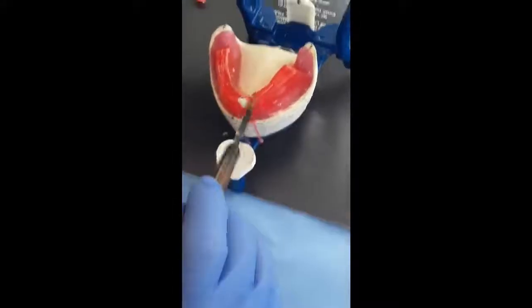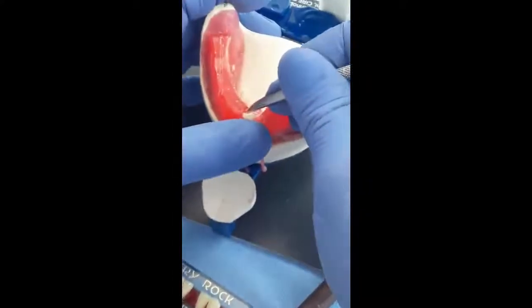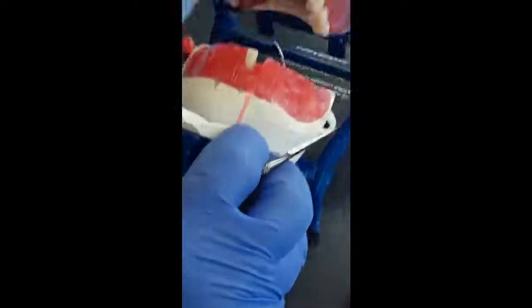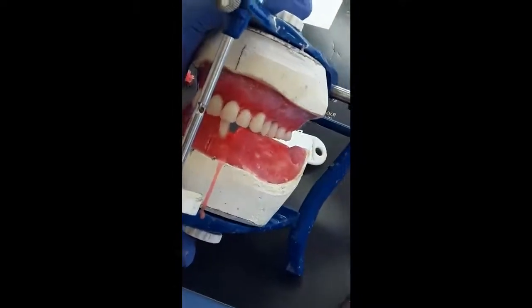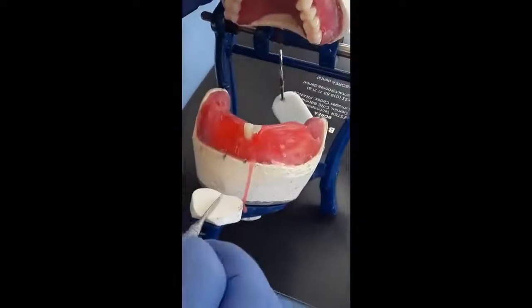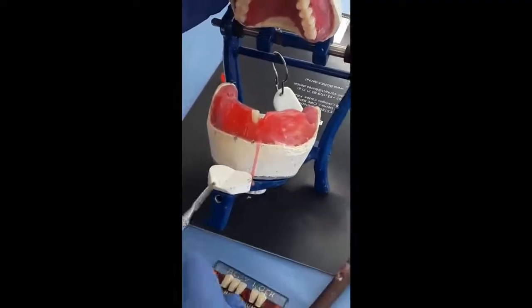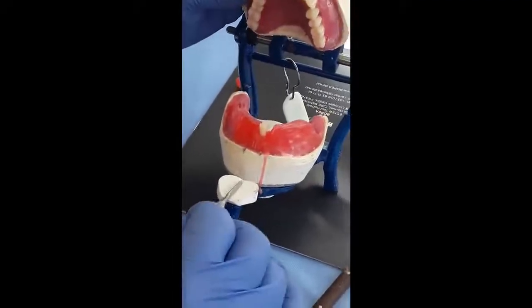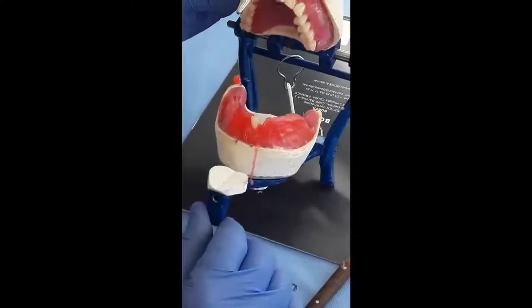Now as you remember at the beginning of this video, I mentioned that the incisal guidance angle we create in our setting must be the same incisal guidance angle set at the articulator, at an average value of about 15 degrees.